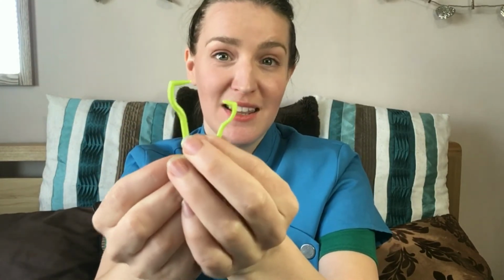And you basically just choose the correct size that you need for the tick that you're trying to remove, and then, like I say, you just scoop it over the tick, twist until you feel the tick move, and you'll see the legs, big gross, you'll see the legs and the head as you pull it away from the skin. But don't pull until you've twisted at least 3 or 4 times. And it sounds really complicated, but trust me, it's not. And then you remove the tick.